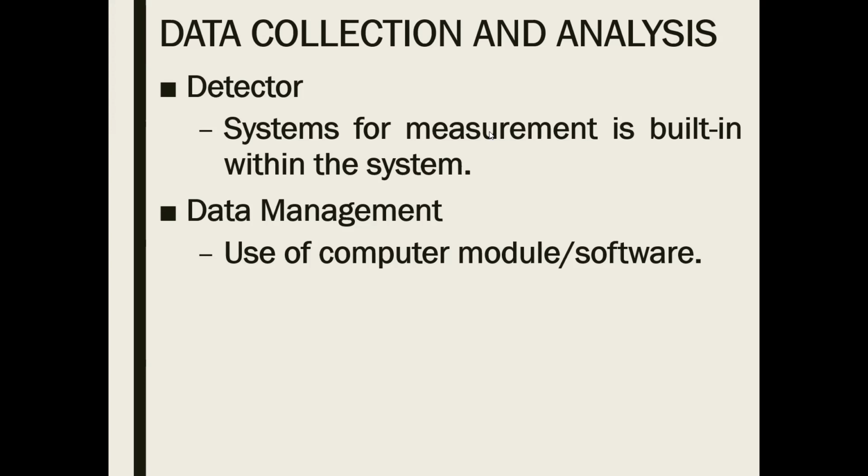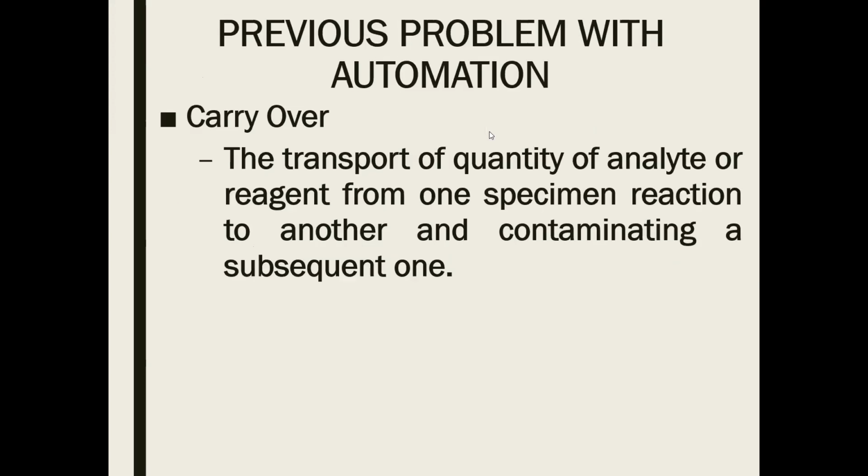Remember guys that laboratory results can be seen in the monitor and can also be transcribed and connected to the printer of our computer where we can automatically print our results. Okay? So again, when we said carry over, that is the transport of the quantity of an analyte or reagent from one reaction to another that can cause contamination in the subsequent one, in the next test to be done.